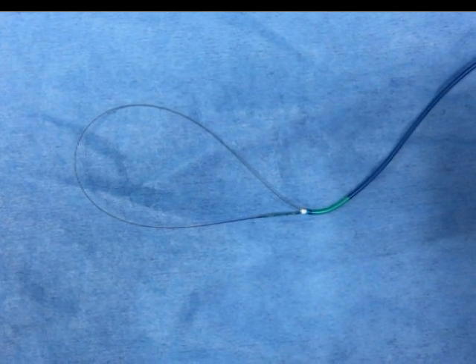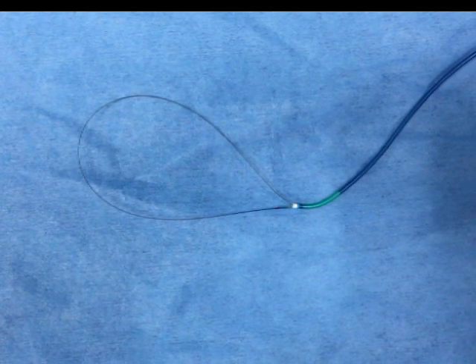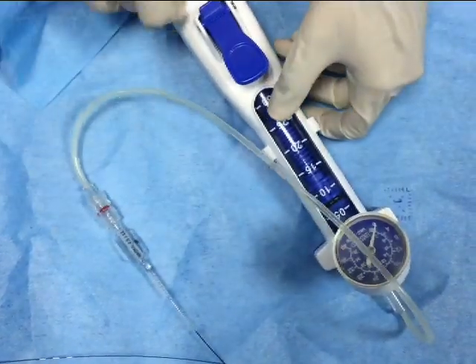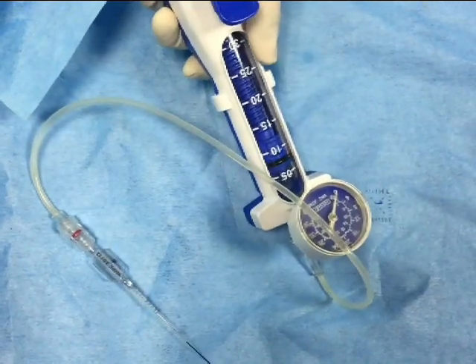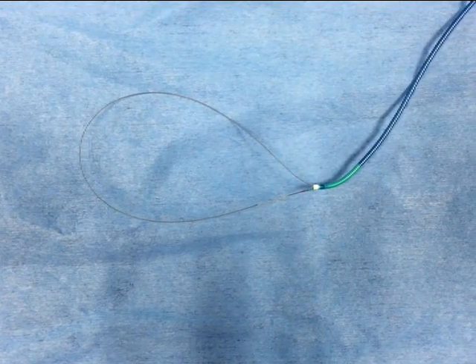Then slowly withdraw the balloon till the distal marker reaches the tip of the guide catheter. Connect to an inflator and inflate the balloon so that the soft tip of the wire is fixed. So we will get a homemade snare.